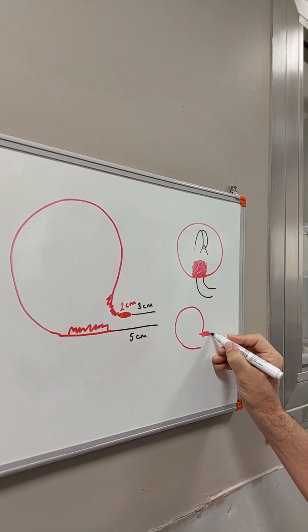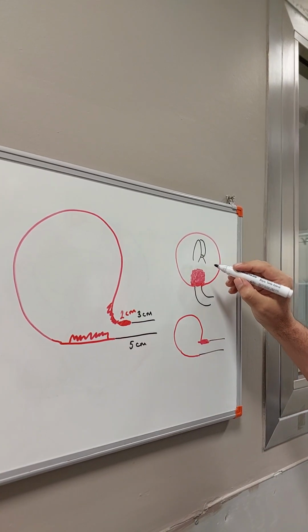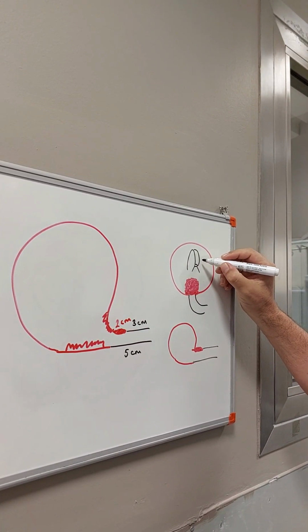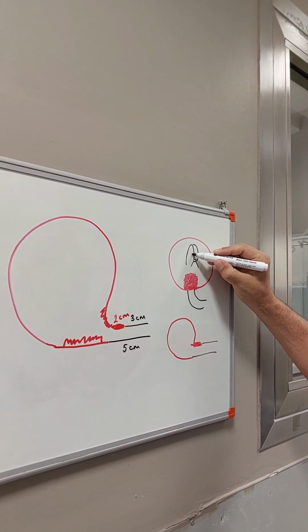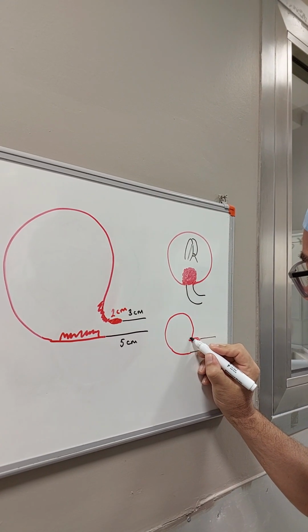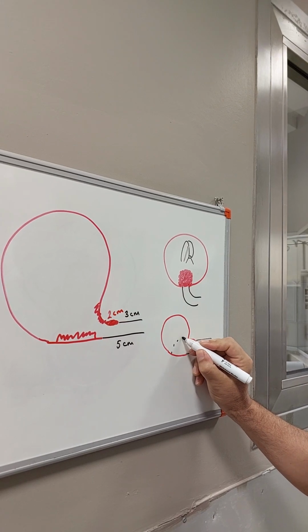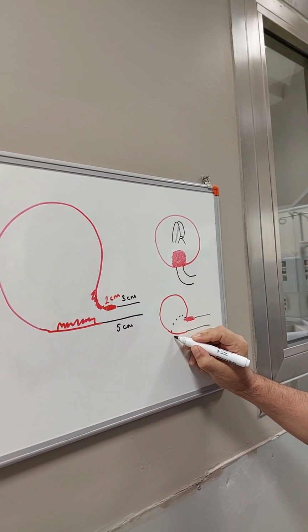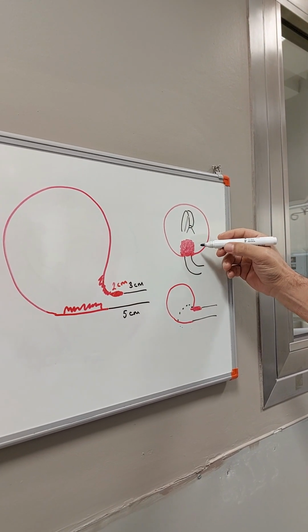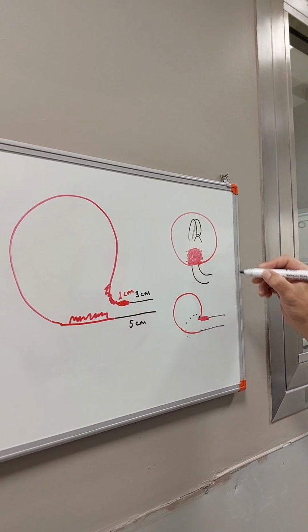As it becomes like this, we make a mark here because with the flexible instrument we cannot do any operation. It is just for looking. So we put a mark here, and we put the borders of the inflamed tissue, and then we go again with the flexible and check if these marks are placed correctly in the bladder neck.